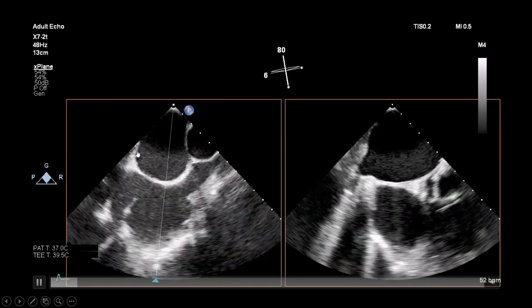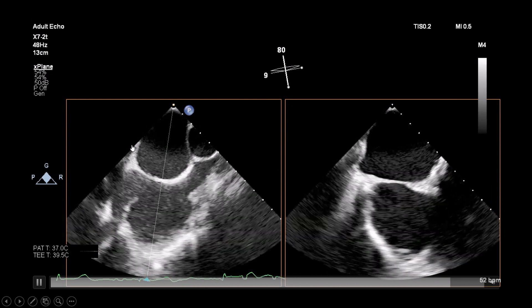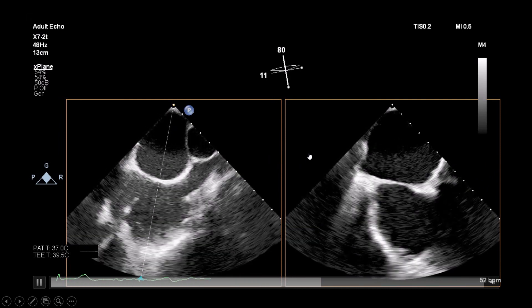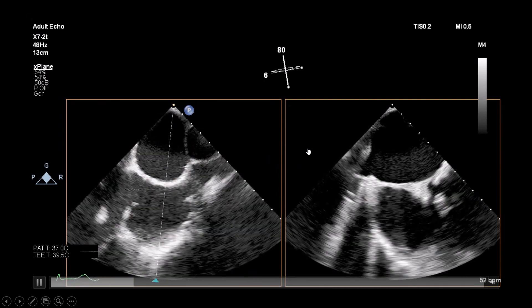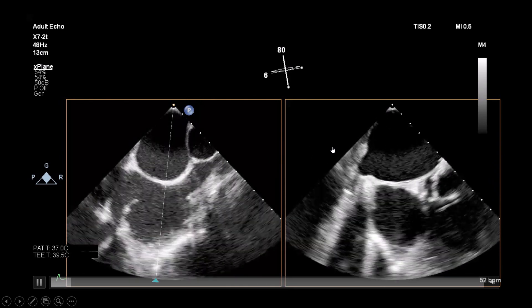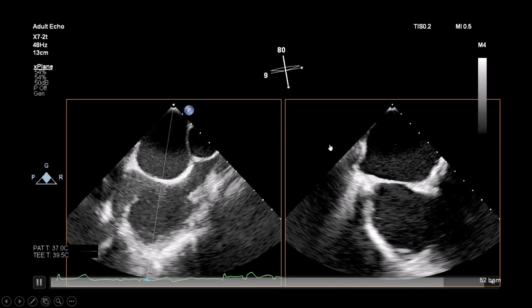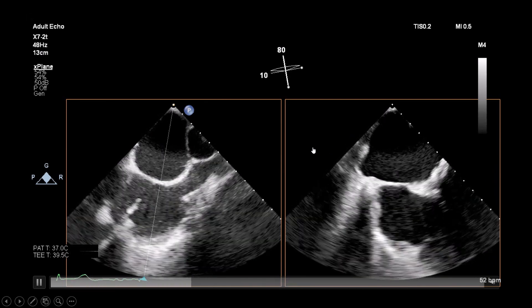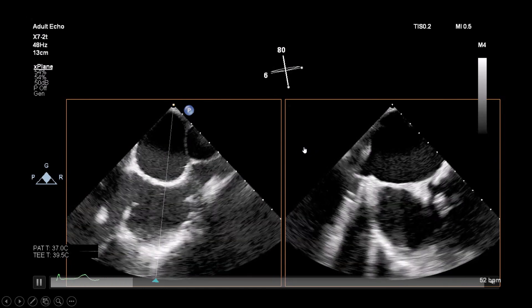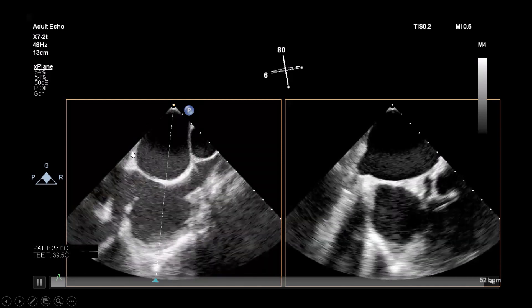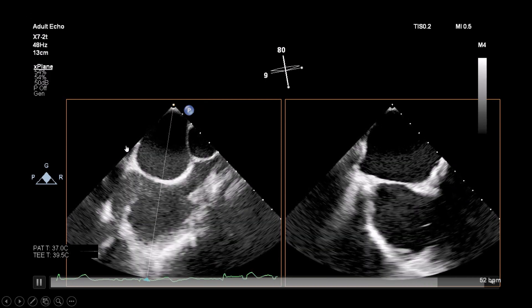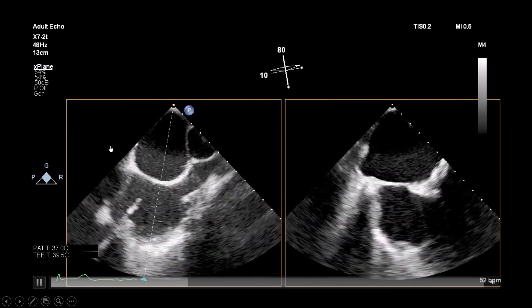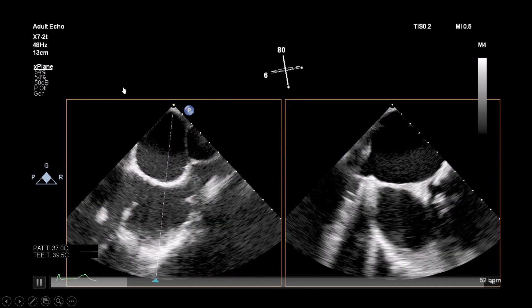Like the MitraClip procedure, we usually prefer to puncture in the superior and posterior part of the septum. For any transseptal puncture procedure, you really need to be in the posterior part of the septum — you never go anteriorly, otherwise you risk puncturing into the aortic root, which is very dangerous. The preferred site is the posterior interatrial septum, though it depends on the procedure: some require the superior part, while others like left atrial appendage closure require the inferior part.